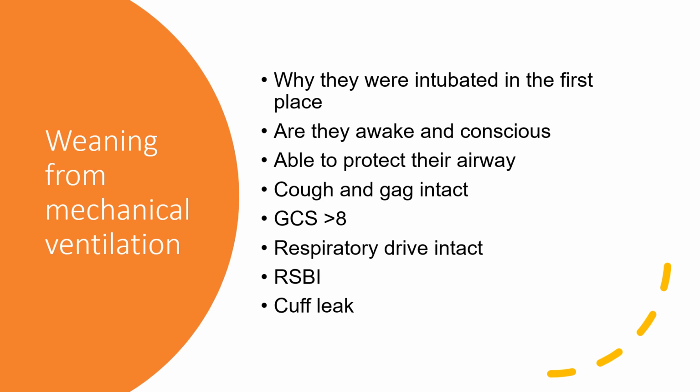Also, some patients can't protect their airway. You got to be able to cough. You got to have a gag reflex. You got to be able to mobilize secretions. You got to be able to take a deep enough breath that you could mobilize secretions, because people fail in extubation attempts because of secretions. Some studies show that you need to have a Glasgow Coma scale greater than 8 to extubate, and this may not happen in patients with head injury, but most patients have a Glasgow Coma scale greater than 8, and you could extubate them.